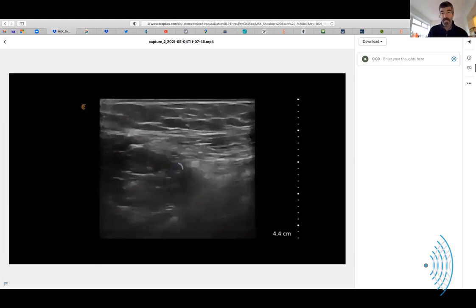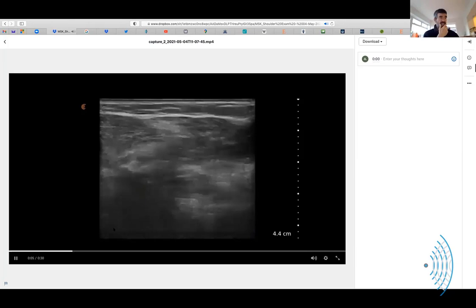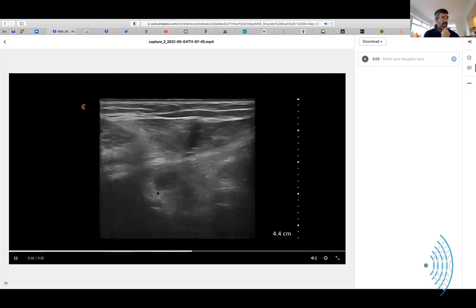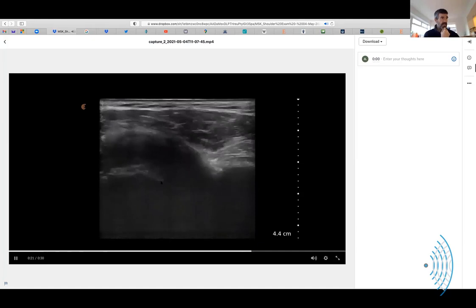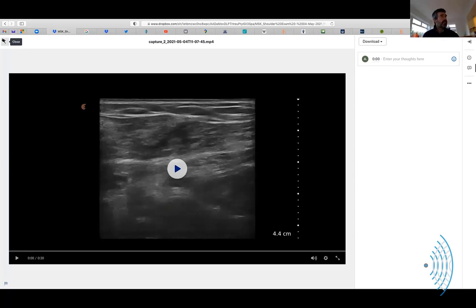But yes, this is not working. So we'll go back and try again. Because sometimes it's just, yeah, there we go. You've got to think that this is your biceps. It's coming up there. Let's have a look. Tuck under, you can see it there, with a little bit of fluid around it, hard to follow coming up, probably ending somewhere near there. You're not keeping tight enough on it as you come up. Yeah. But they're not always straightforward to follow. Look.